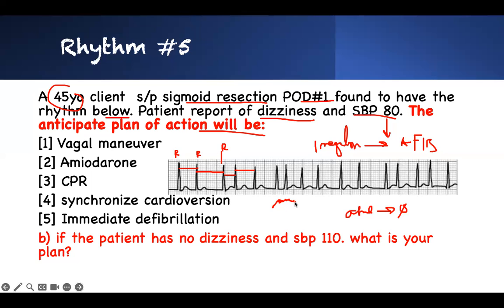It's different from ventricular fibrillation. So the atrium is fibrillating. It's like shaking, like it's acting out. The blood is there, it's just rotating, not doing anything, right? It's a fast rhythm, and you have to calculate. You can see from here, there's only one distance, so I can assume the heart rate is greater than 150. But you have to get a full 60 seconds and then you can calculate.